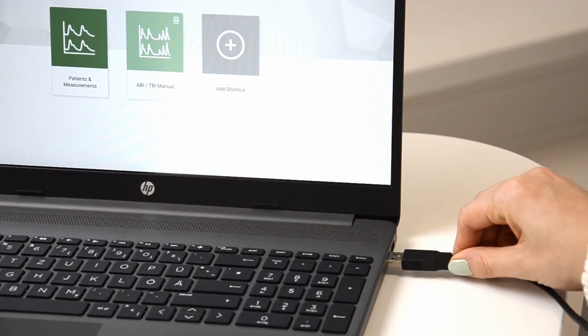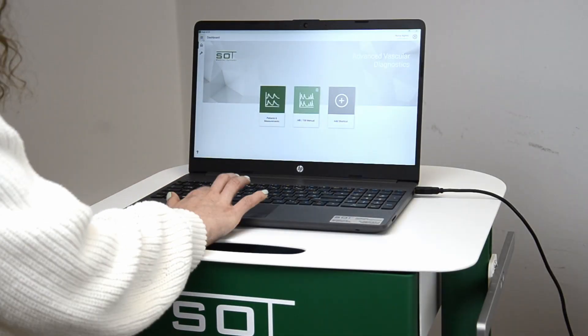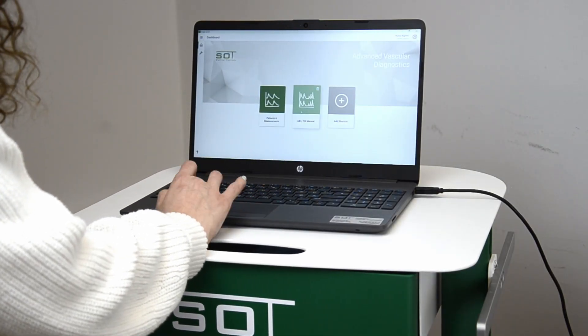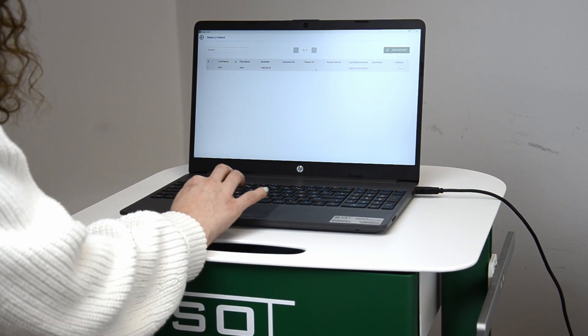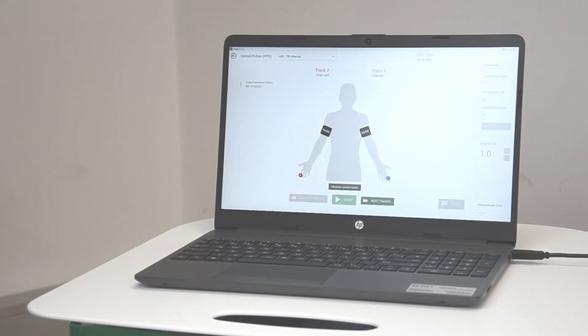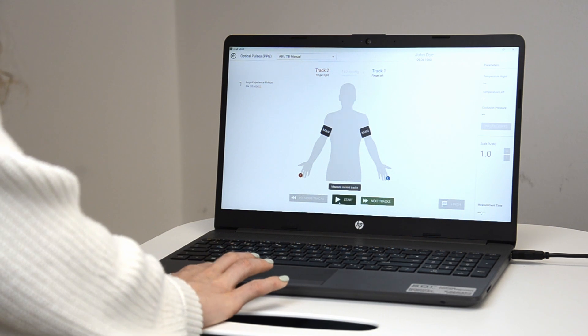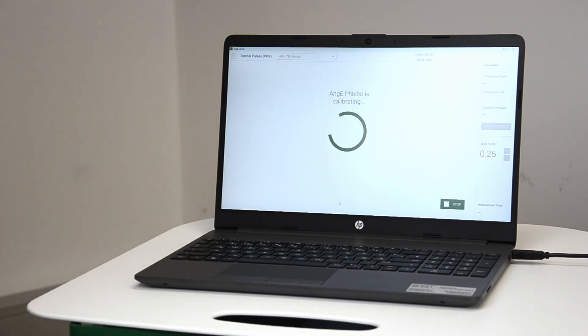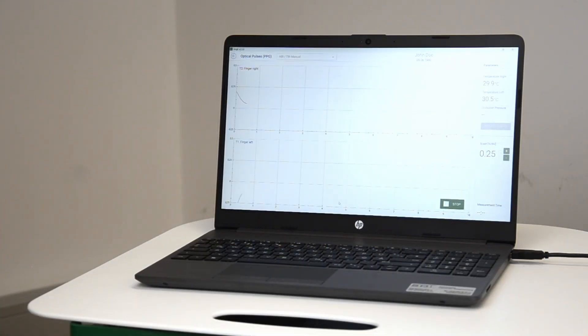Connect the USB cable to the computer. Select the patient or create a new patient in the software and select new measurement. Follow the on-screen guidance. Start the measurement and wait a few seconds for the optical sensors to calibrate. Make sure that you see good quality pulse waves on both sides of the body.